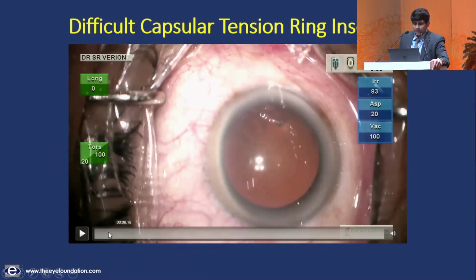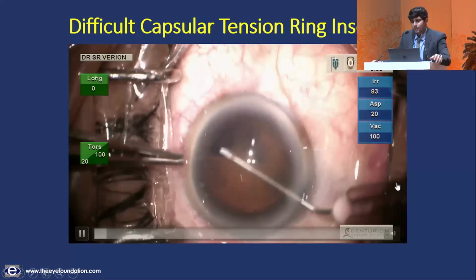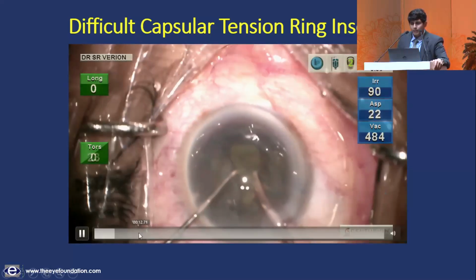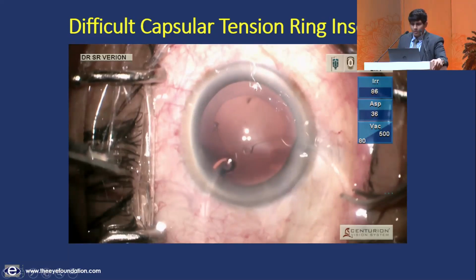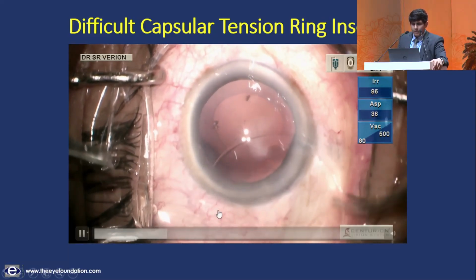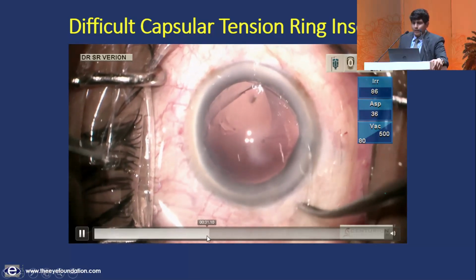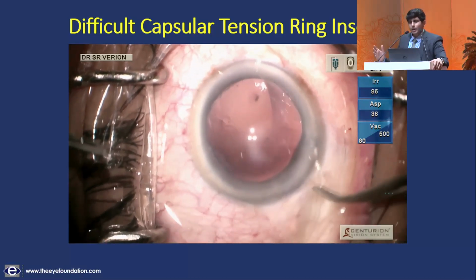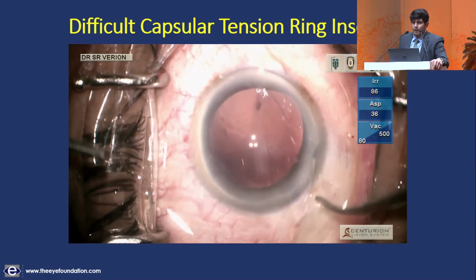This is what could happen if the capsular bag is not adequately supported during the implantation of a capsular tension ring. This was an uneventful surgery, but zonular weakness was noticed. A successful phaco was completed, but as the capsular tension ring is being threaded into the eye, one notices a gross displacement of the bag, and if one were to continue at this stage, you probably lose support of the remaining zonules that remain at this inferotemporal quadrant.